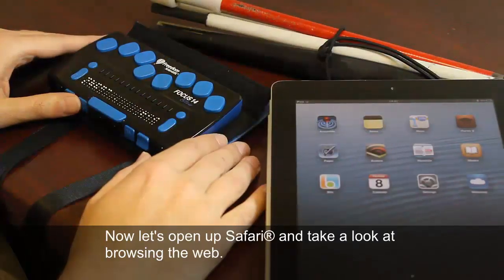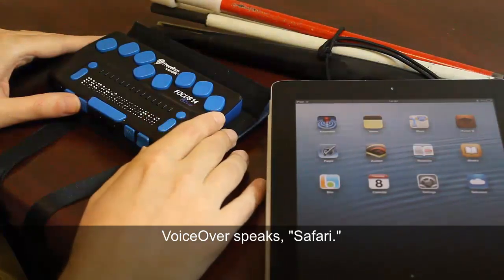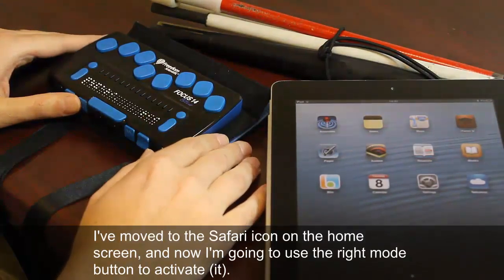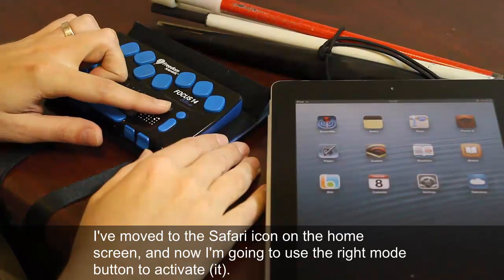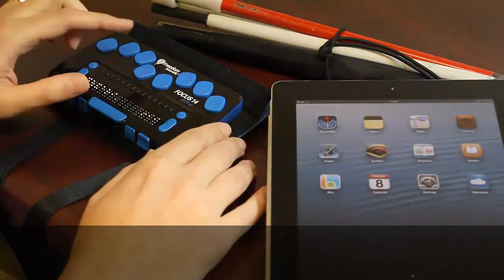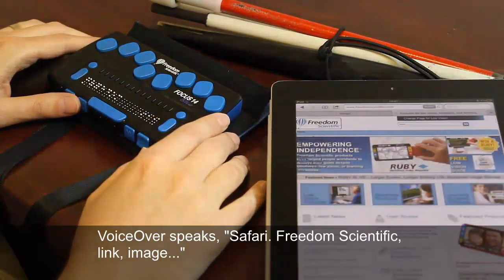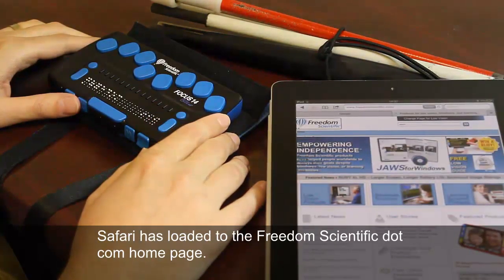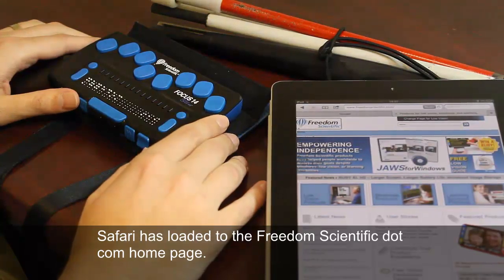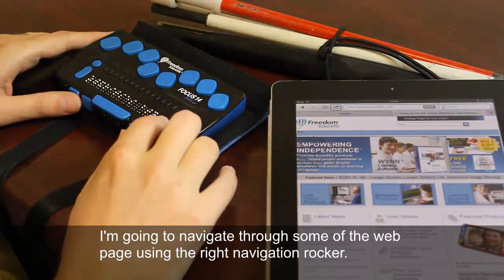Now let's open up Safari and take a look at browsing the web. I've moved to the Safari icon on the home screen and I'm going to use the right mode button to activate Safari. Safari has loaded to the freedomscientific.com home page, and I'm going to navigate through the web page using the right navigation rocker.